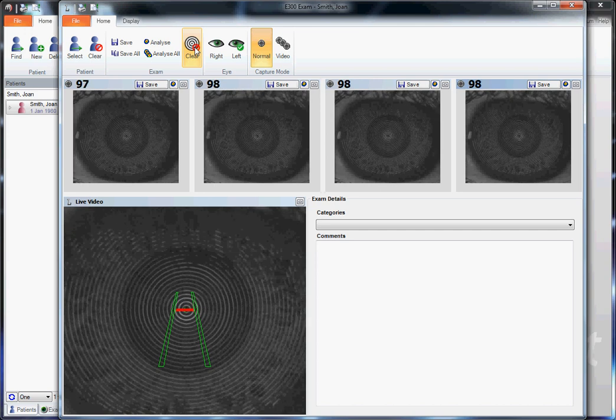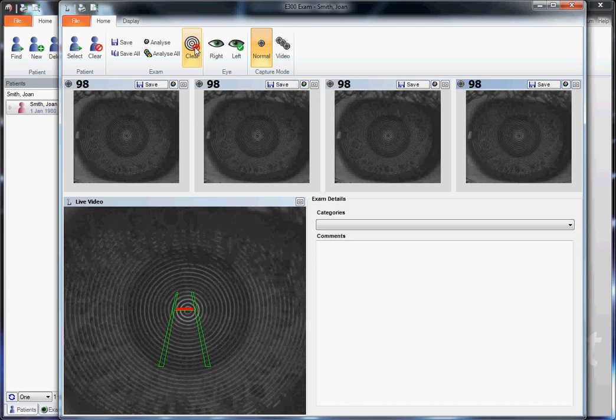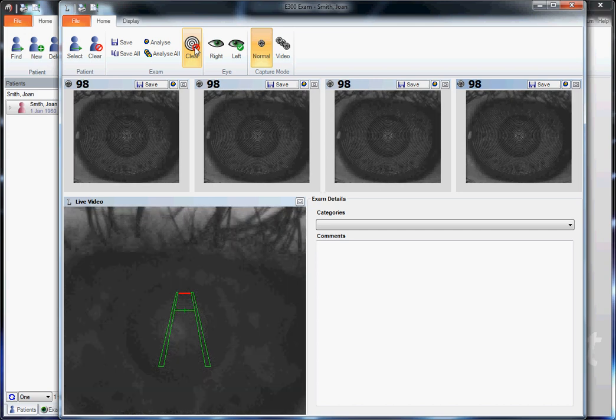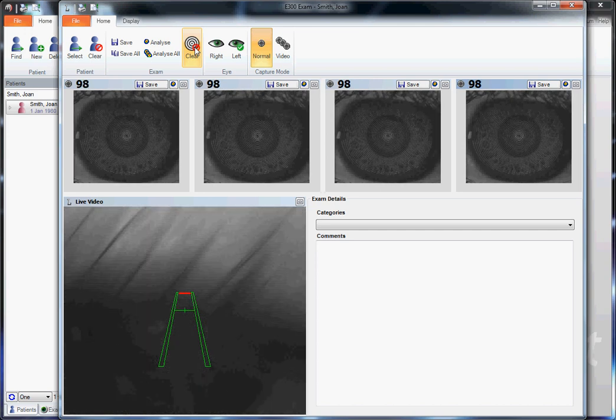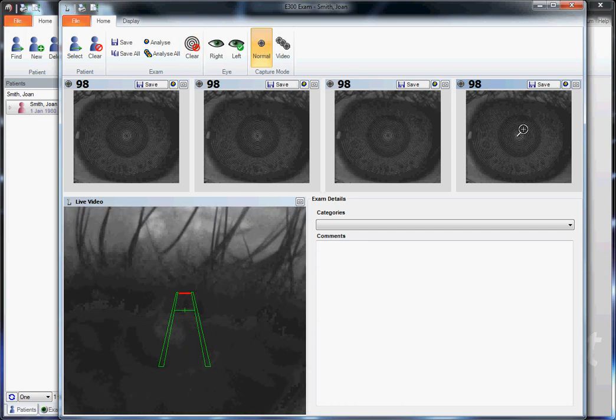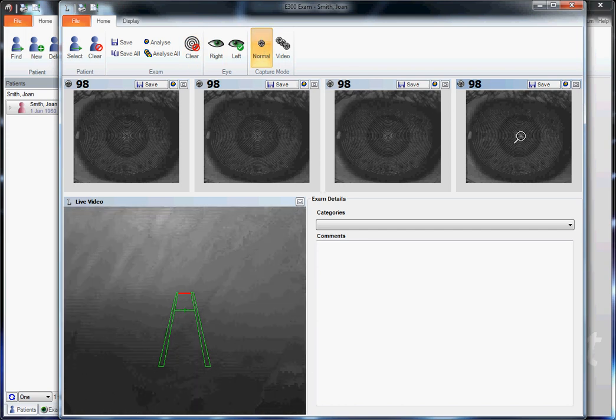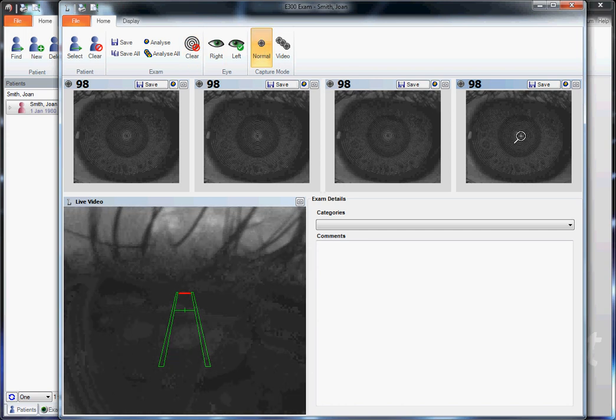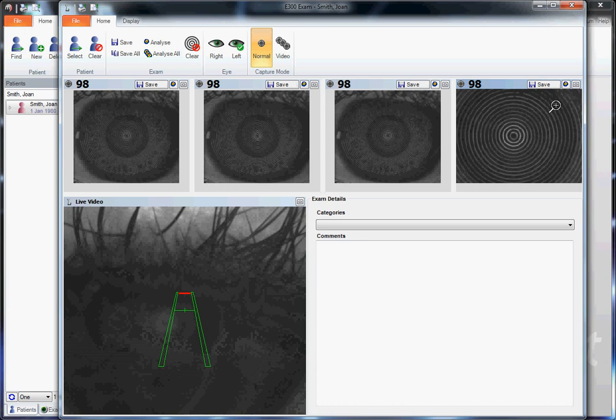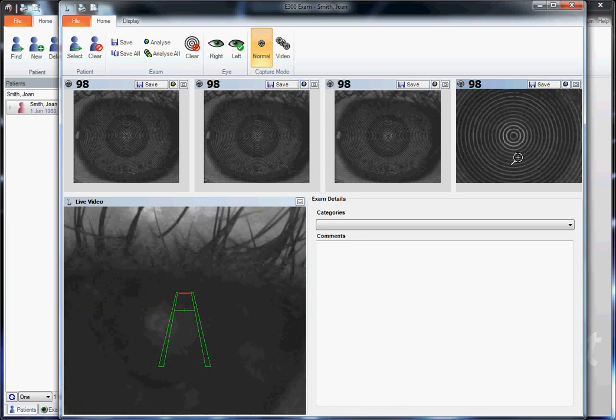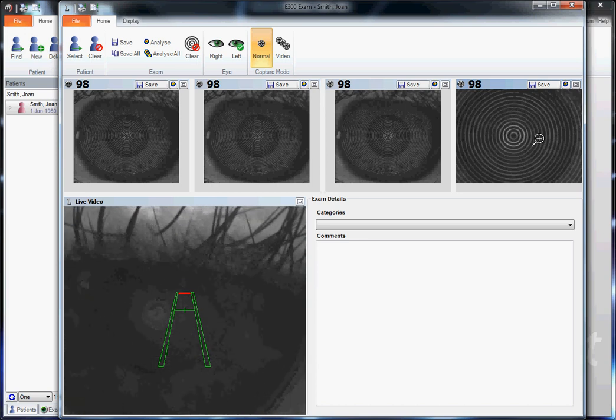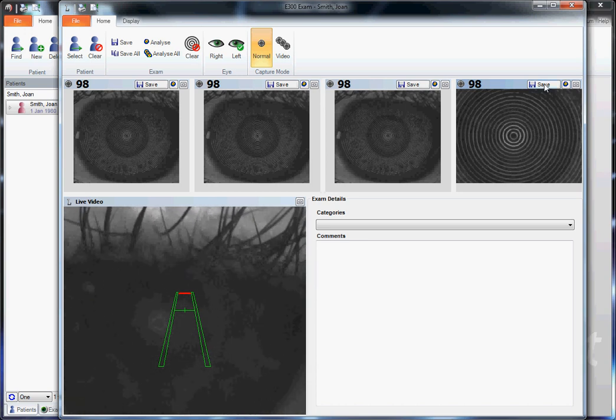While the Placido looks like it's reflecting parallel and even, we'll move it into the center or ask the patient to blink to smooth out that tear film. Again, zoom in to make sure the rings look parallel and even to each other before clicking save.